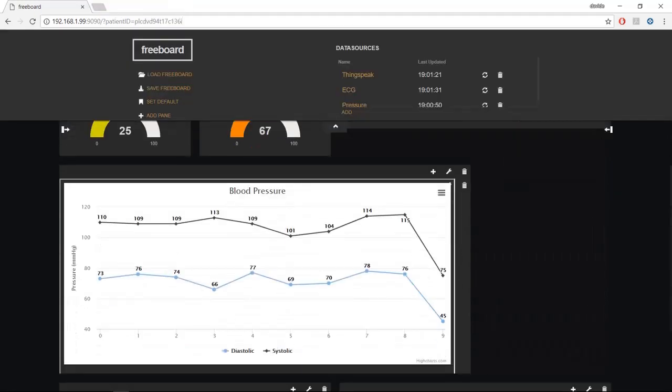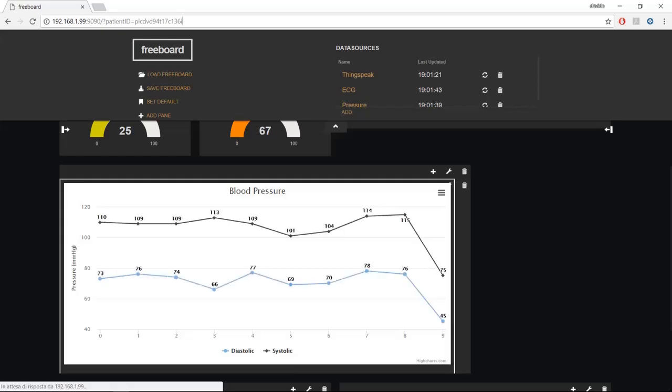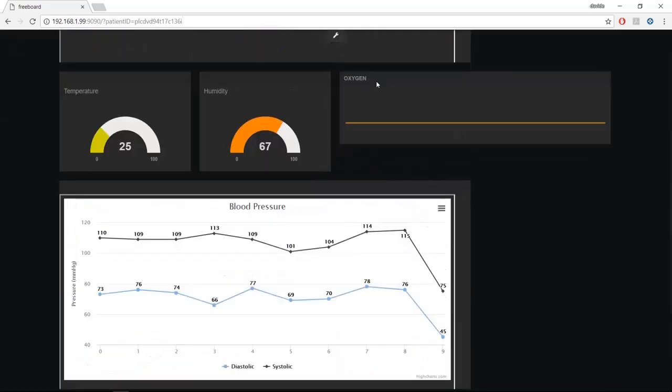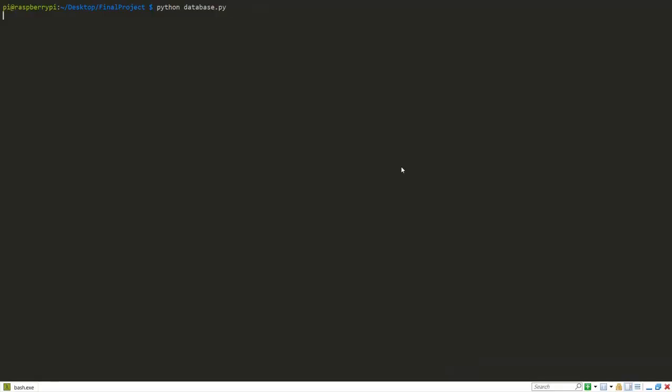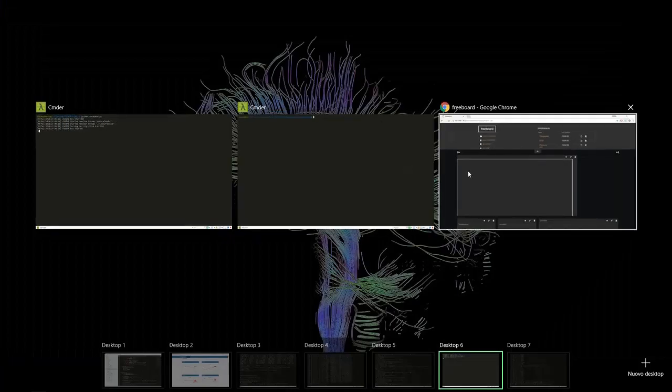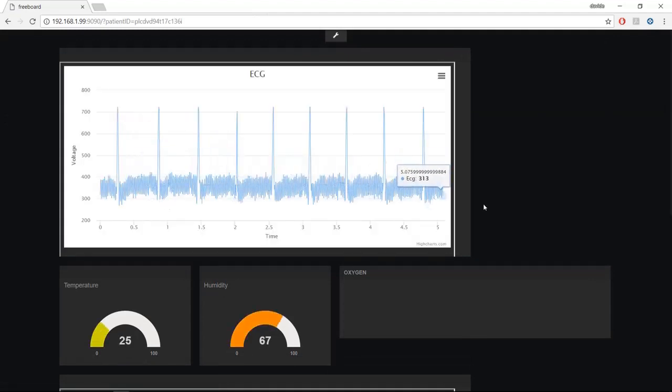In this chart we can see the last measurement of diastolic and systolic pressure. These measurements are taken from ThingSpeak but are plotted using the Highcharts library. Instead, now we will see, if we run the database on the Raspberry where all the pictures and all the ECG traces are saved, we will see something. Now, if we run the database and we refresh the page, we can see here the last ECG trace.